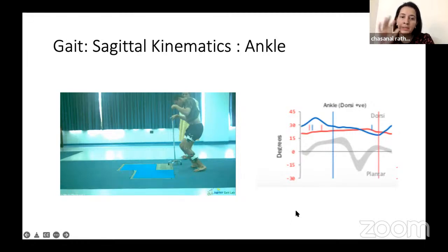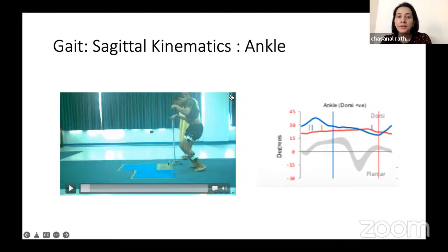So that's how the apparent and true equinus and the dorsiflexion are much better picked up on gait graphs as compared to the clinical findings. Everyone can argue or have their own opinion because what we see and feel is very subjective. But based on the lab and the marker systems, it is going to let us know the foot, what it is in correlation with the tibia, and how the tibia is with the femur, and how the pelvis and femur are correlated, and how is the pelvis in terms of the lab. So that's how we come to know that.